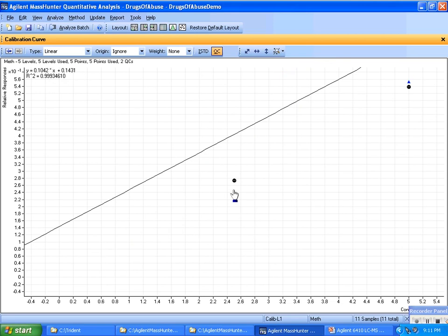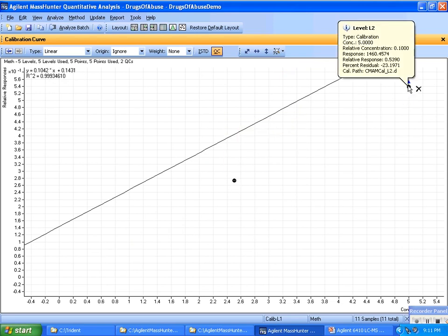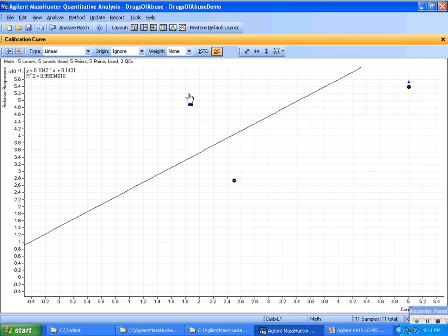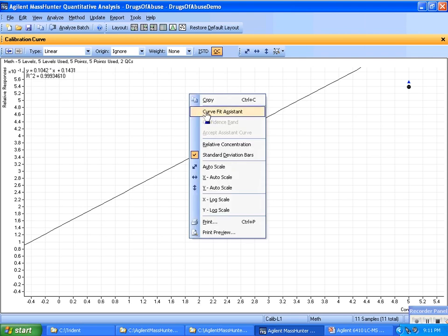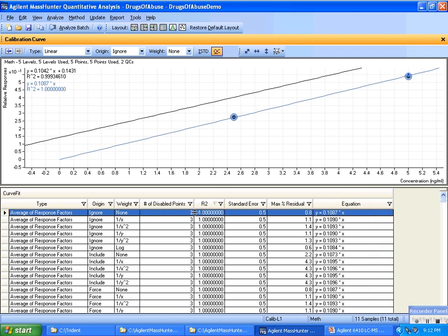You can see the line is here and the points from the calibration point as well as the QC are not really falling on the line. So what I'll do next is use a tool called the CurveFit Assistant. The CurveFit Assistant is going to make calculations for every possible combination of CurveFit, as well as statistically decide to disable 1, 2, and 3 points, and then sort those by R-squared. It also tells you standard error and maximum % residual.